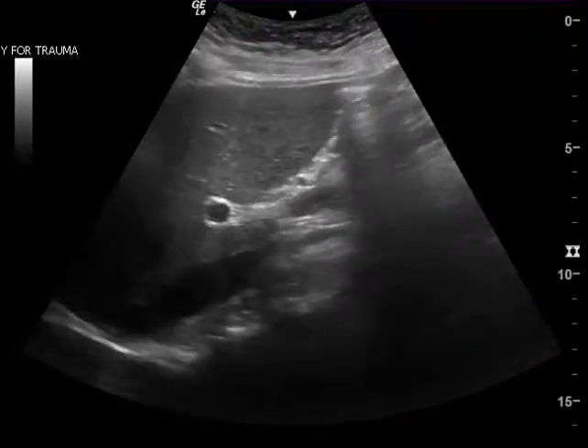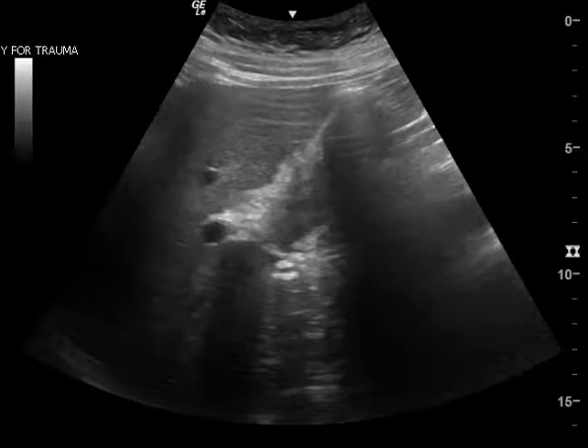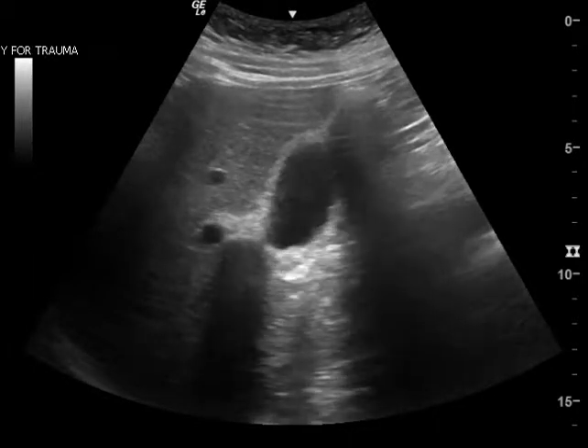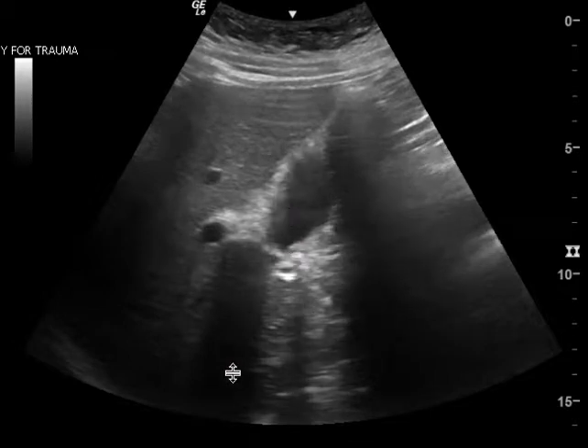But it's when you slow it down and freeze it right in the beginning, as you're heading towards the gallbladder neck, you see some shadowing that is consistent with a stone. You can see there is some shadowing there, and I do believe it is from this little bright thing right there — a stone.